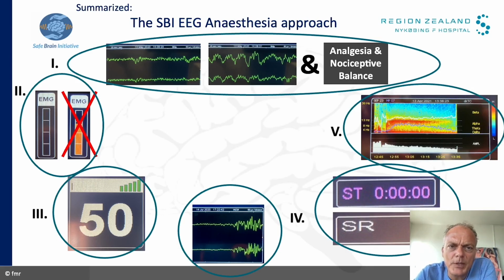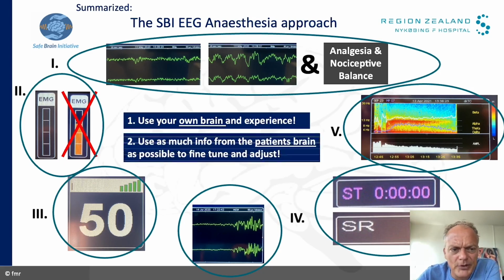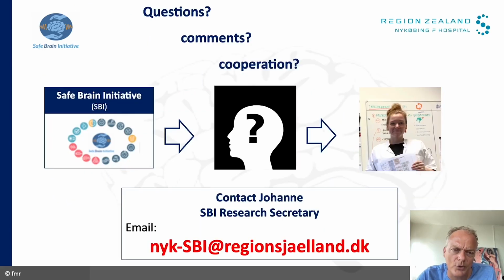After the induction phase, we switch to the DSA, where you can track the anesthesia over time. It can also allow you to see how the patient will most likely wake up, according to the end phases of the DSA. And most importantly, always use your own brain with all kinds of monitoring that you do. Does it generally make sense? Are these numbers trustworthy? And how does what you see relate to your experience? And of course, use as much information from the patient's brain as you can get in order to decrease the sedative and analgesic load on your patient, in order to avoid these postoperative cerebral disturbances.